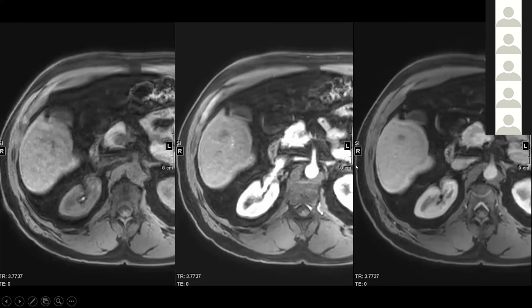And when you're saying hypo to more hypo, do you use ROIs when it's not clearly apparent to you? To me, this looks like similarly hypo. Right. But I might put ROIs on it. Is that legit? Right, so this was another point of discussion. How do you make sure that something goes from hypo to more hypo, particularly in MR? Because on CT at least you can put ROIs, on MR not really.